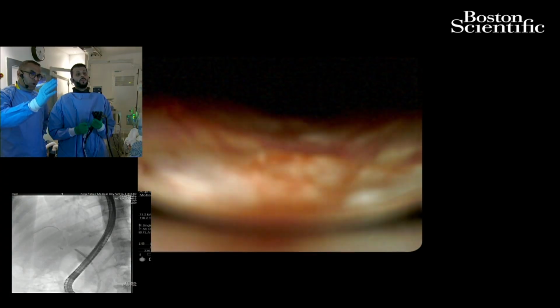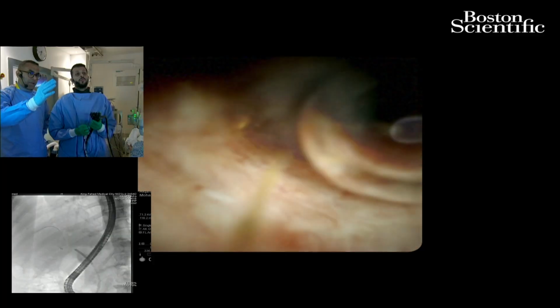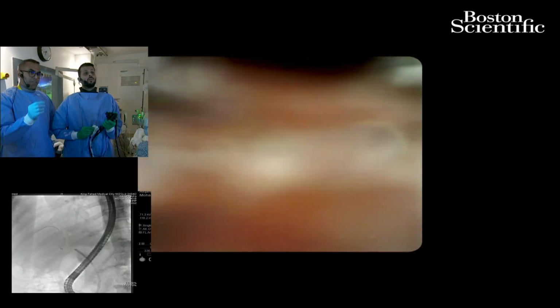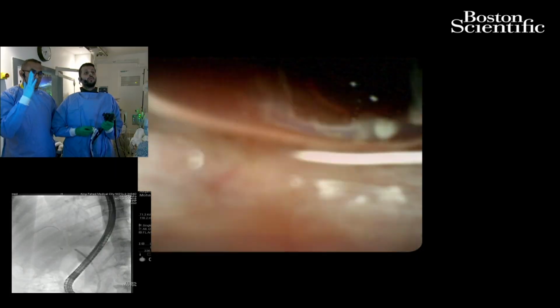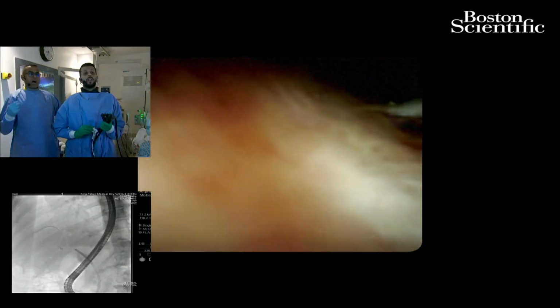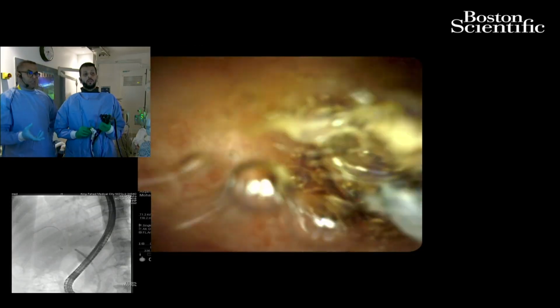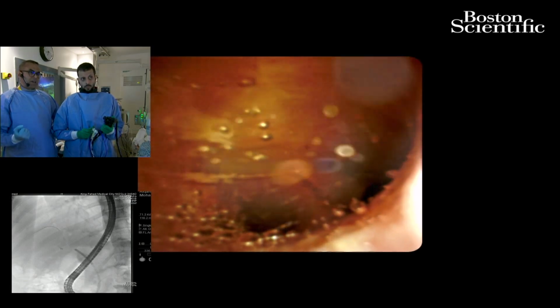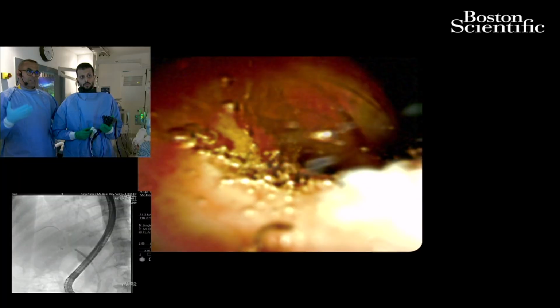If Saad could push the scope more proximal, higher, you would see that those changes disappear and you would have a much healthier appearing duct with normal mucosa. So irregularity by itself, increased vascularity, easy to bleed, different stricture types, these are all indicators that there's something abnormal.